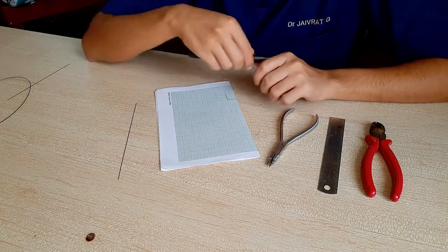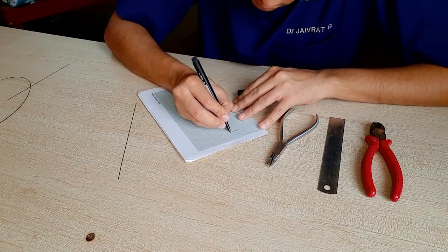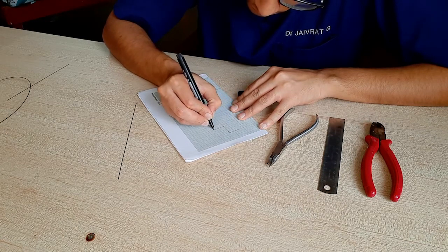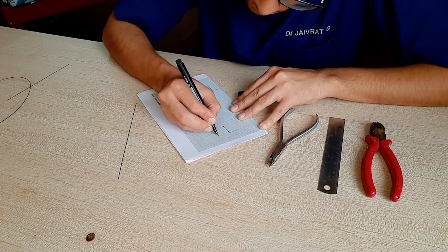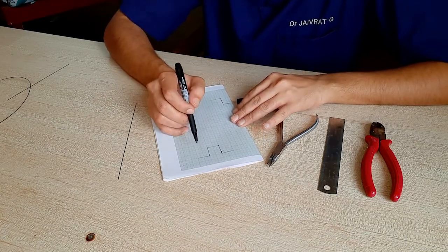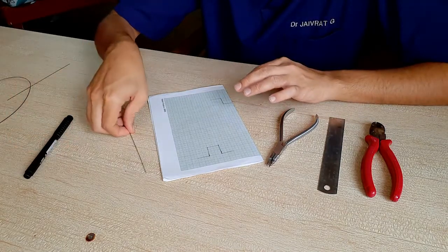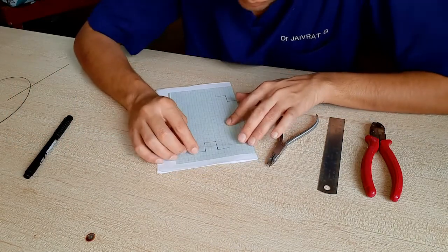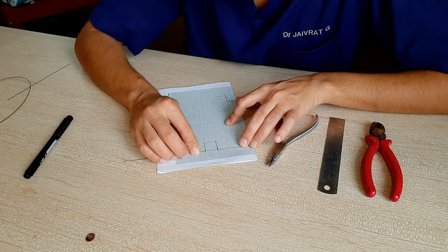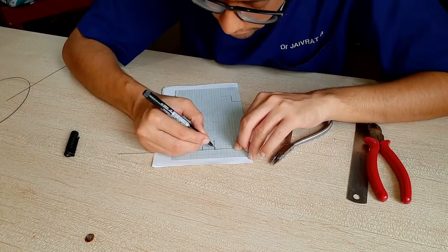For example, you've been given an activity of making a U shape. So we'll first make the U on graph paper — all the dimensions here are 2 centimeters. How we'll go about this is that first we keep the wire on the line and then we mark at one point where you want the bend to be.